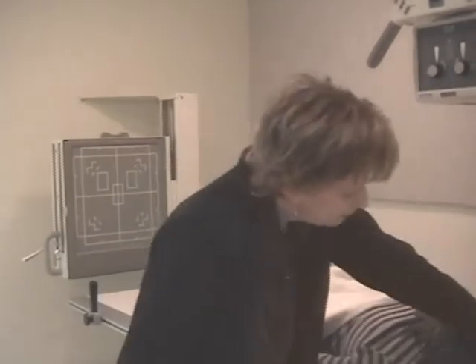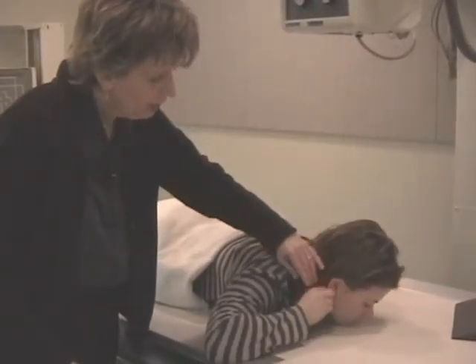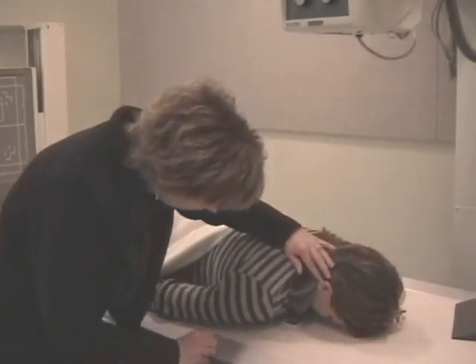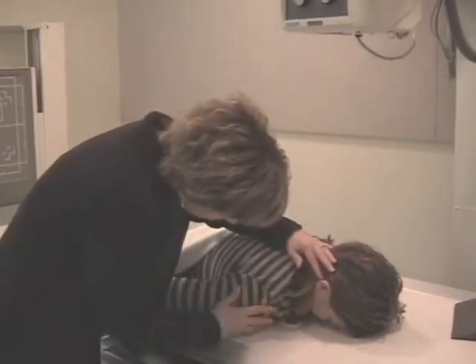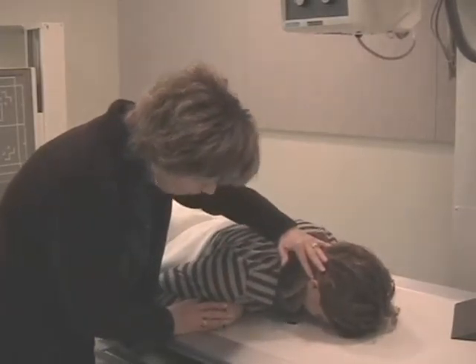So we're going to go back to our patient now. A PA is basically opposite of an AP. And in doing so, we need to have our patient tuck their chin, put the forehead on the table, and I want the orbital meatal line perpendicular. She needs to tuck her chin a little more. And notice how she moved her arms up here.